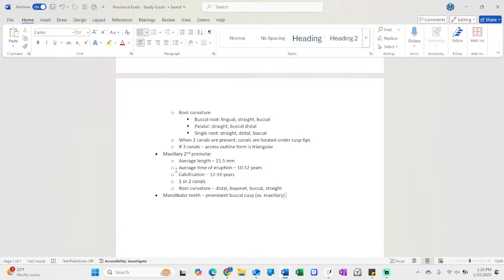Let's begin. Remember what we said? All your accesses at this point should start in the center. Okay? So, visual representation. Hopefully you guys are more into pictures than words.